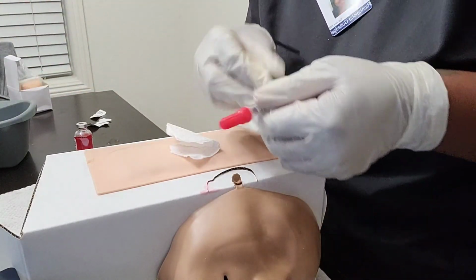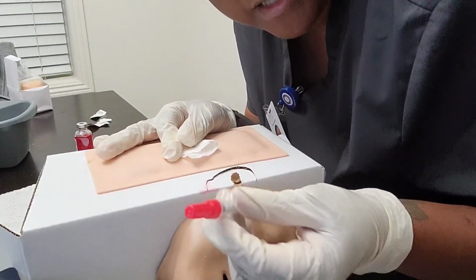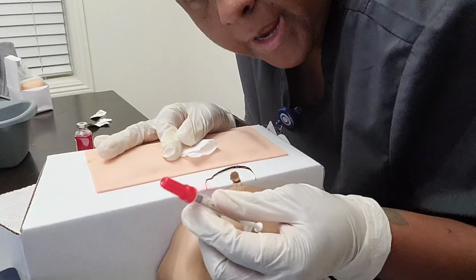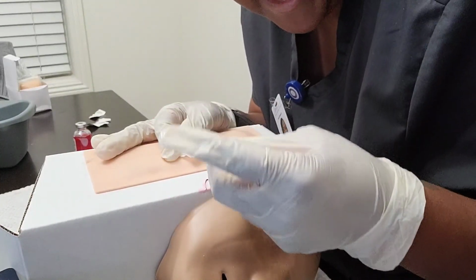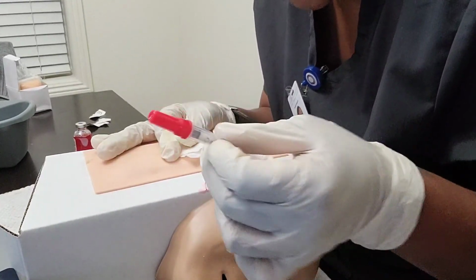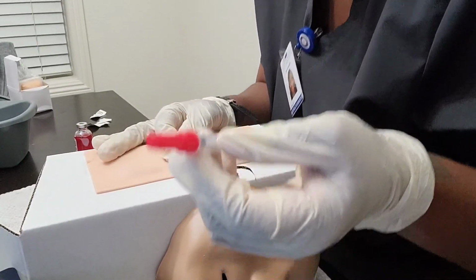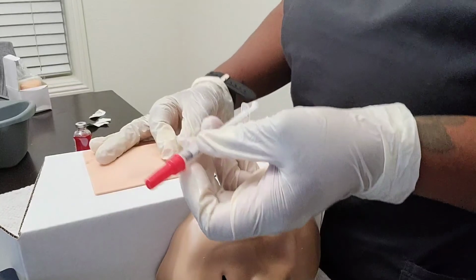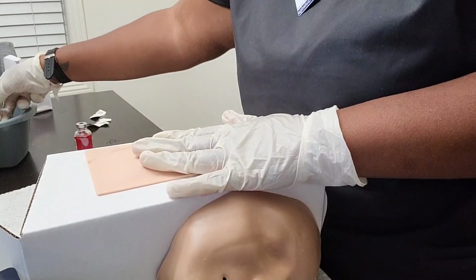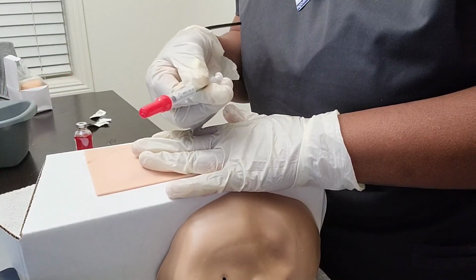I would like to note, you do not cap it, but for safety purposes, because I do have a little baby, a toddler running around, I'm capping it, but noting you do not recap the needle. Never recap a used needle. Just discard the needle and syringe in a sharps or puncture-proof container. But since I'm at home and I have kids running around, I just want to be safe.